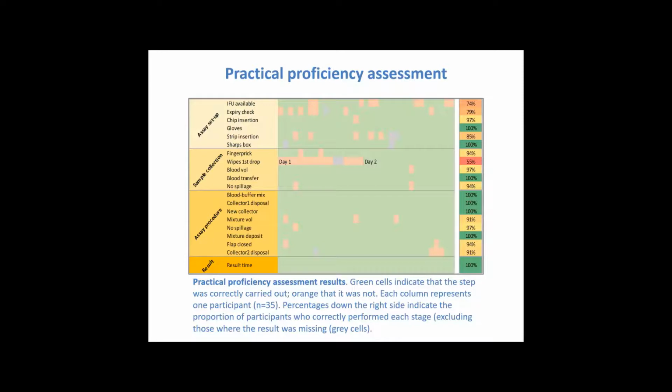the overall good proficiency was observed. However, this was done only a couple of hours after the practical demonstration. It may not be indicative of long-term performance. Next slide, please.